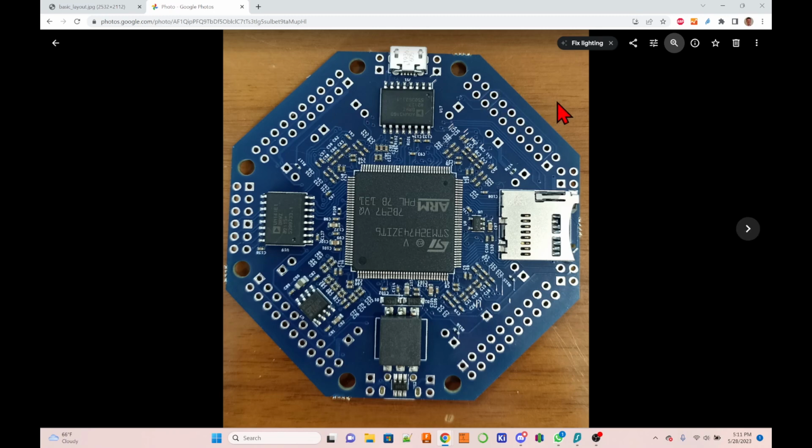I tried to copy Cyton, but I forgot about it while I developed it, because this way is better. It's how it's okay to connect on this ADC. This ADC provides pins from this chip, so it was unable to connect a different way. So yeah. Okay, so minuses inside the board, pluses outside.